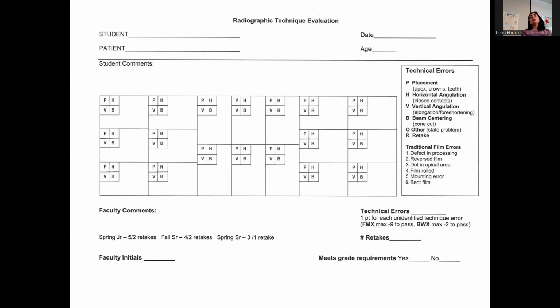And so if you need to move for this maxillary PA, if you need to move posterior and down, or posterior and up, let's just say, you'll shade here and you'll shade here. But if the same thing happened over here, you'd shade back here and up here. So it has to mirror it.